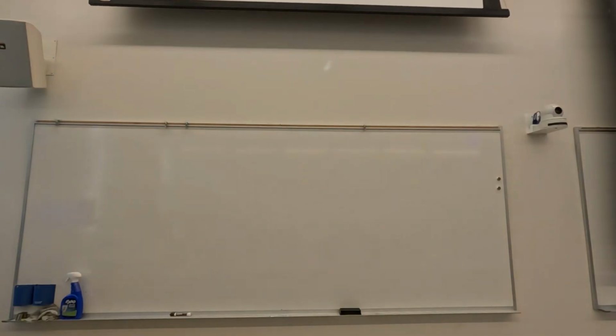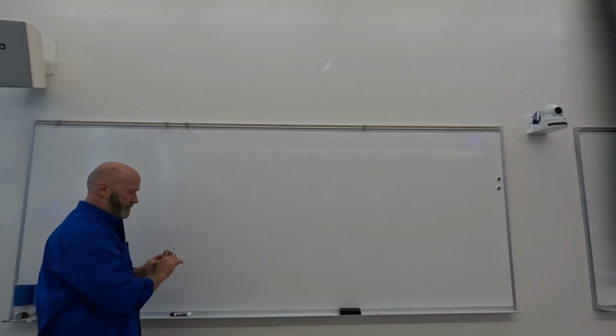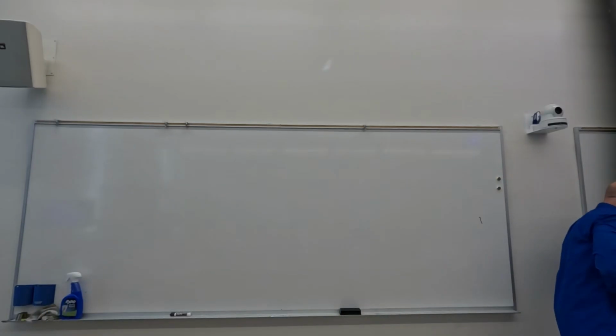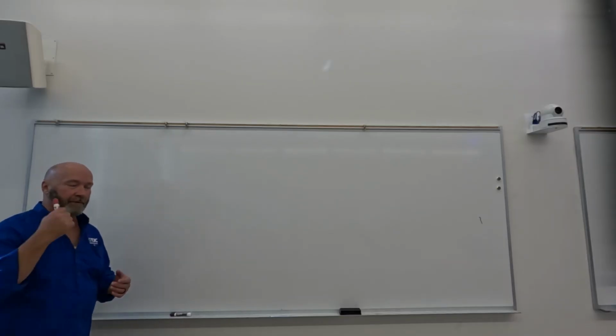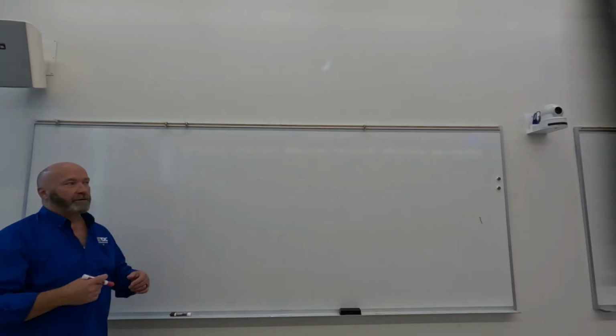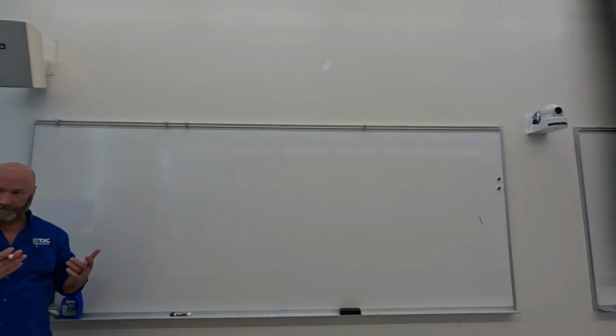We're going to talk about the beam spectrum. So if you remember, and I know it's been a minute, the beam spectrum is the emission spectrum. The emission spectrum, and this is emission from the X-ray tube and not emission at the anode. So I'm going to draw the anode first, and then we're going to talk about everything else.